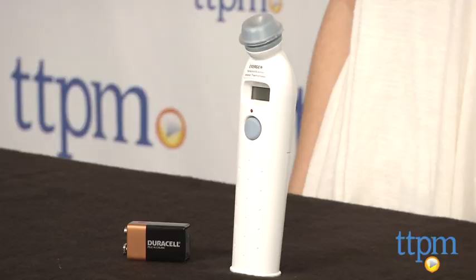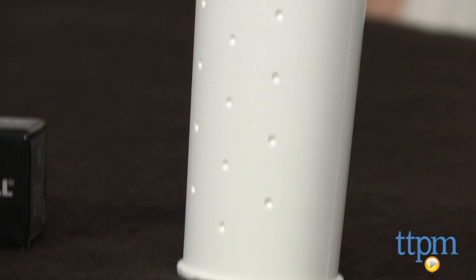The Temporal Artery Thermometer measures the core body temperature, which is comparable to using a rectal thermometer, though much less invasive.